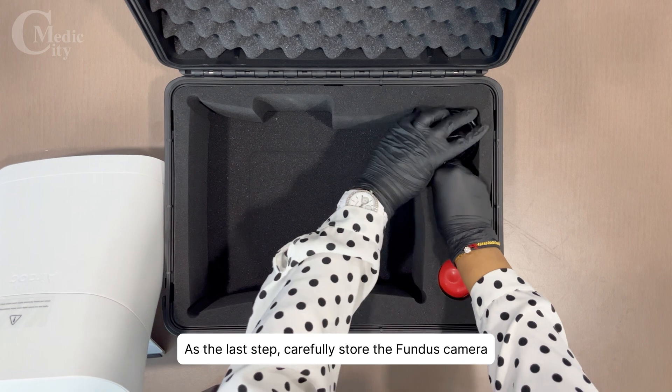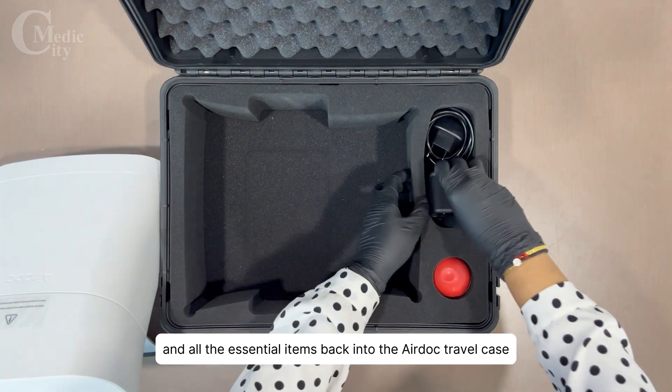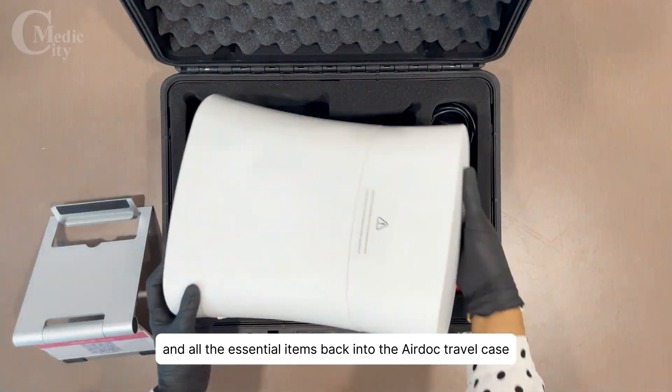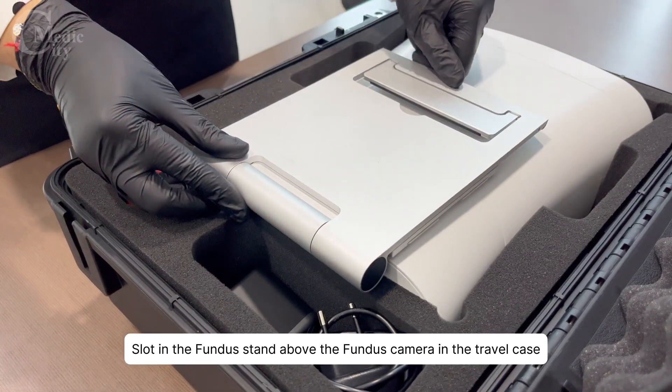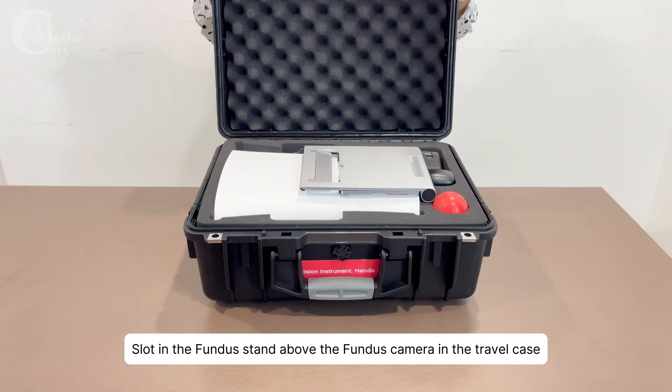As the last step, carefully store the Fundus Camera and all the essential items back into the AirDoc travel case. Slot in the Fundus stand above the Fundus Camera in the travel case and close it down.